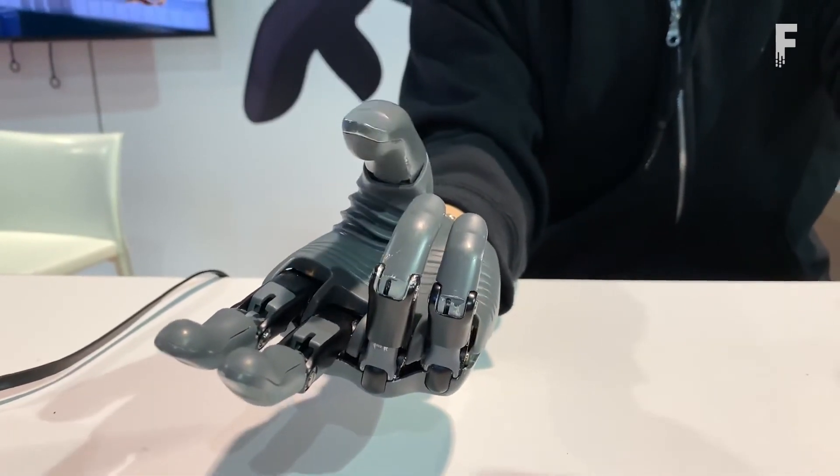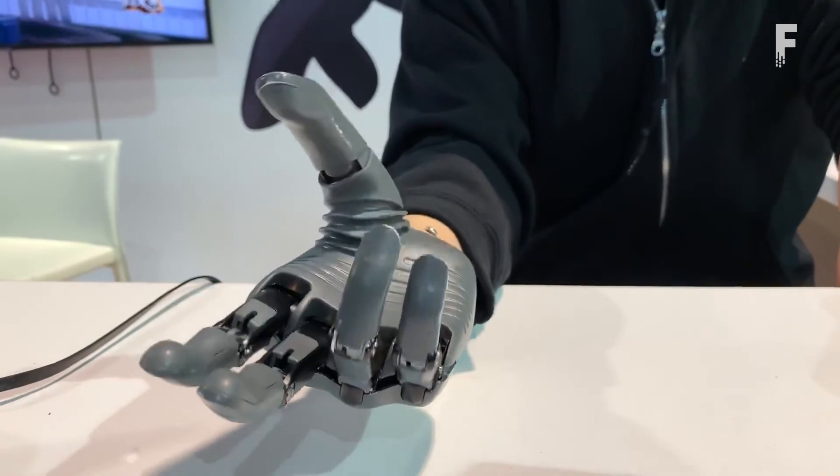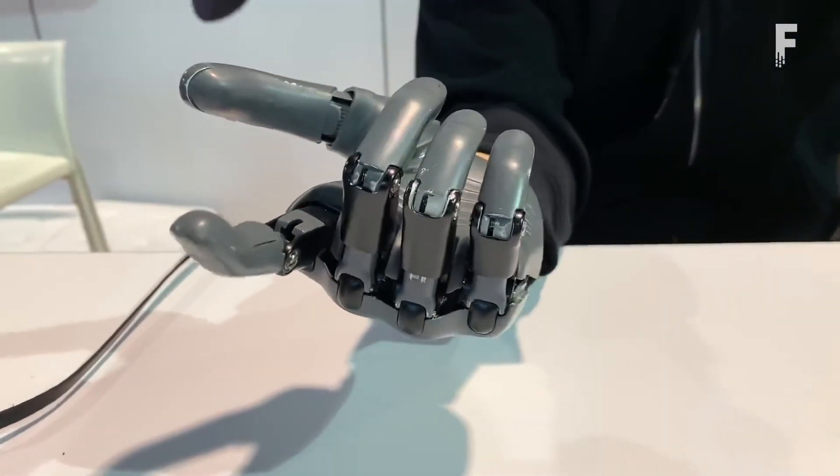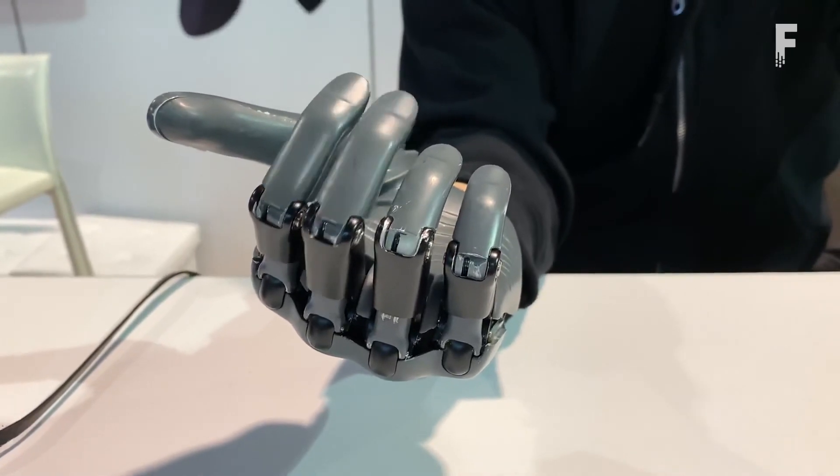In addition, the integrated AI employs an algorithm that allows the hand and user to interactively learn from each other, making the movements more lifelike with each use.